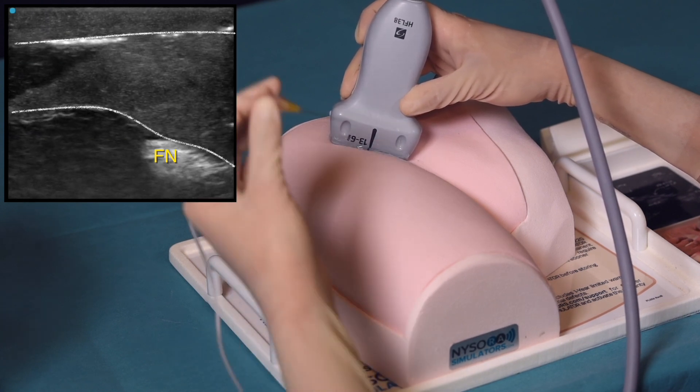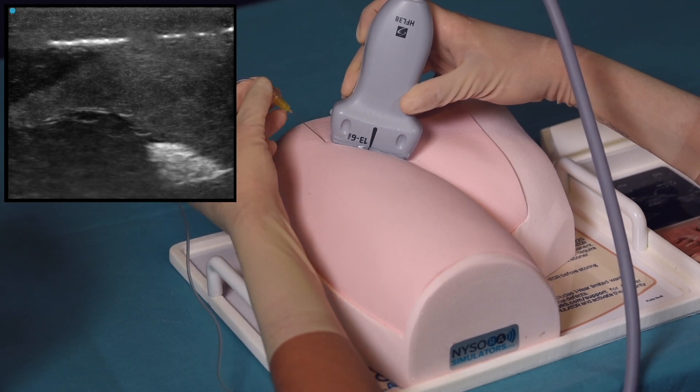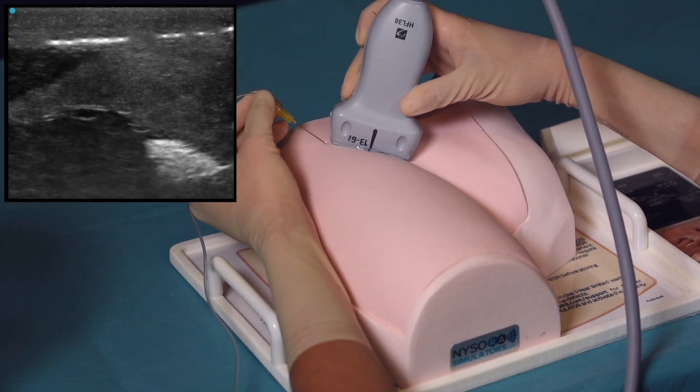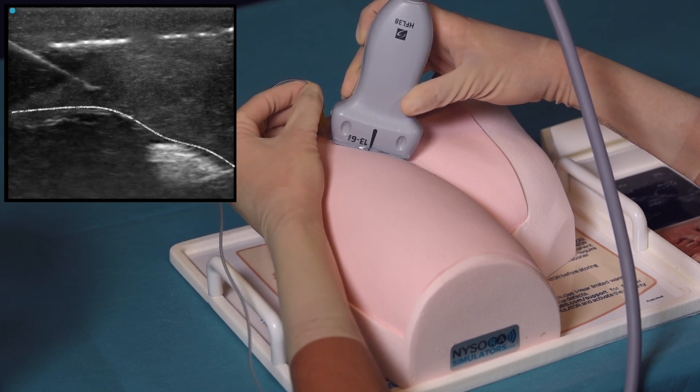Once the femoral nerve and fascia iliaca are identified, the needle is inserted in plane towards the femoral nerve. The needle angle of insertion is adjusted until its tip is positioned under fascia iliaca, just lateral to the nerve.